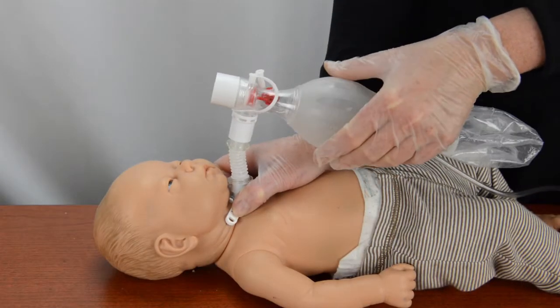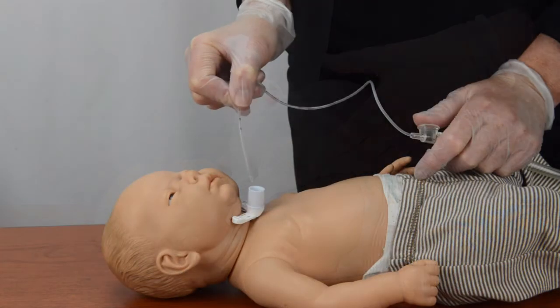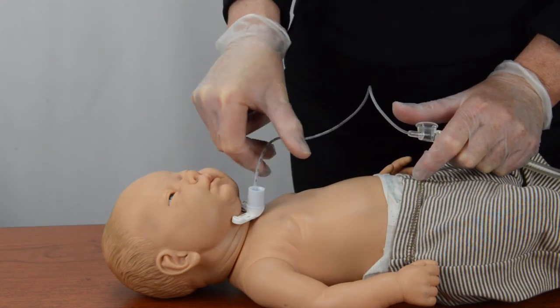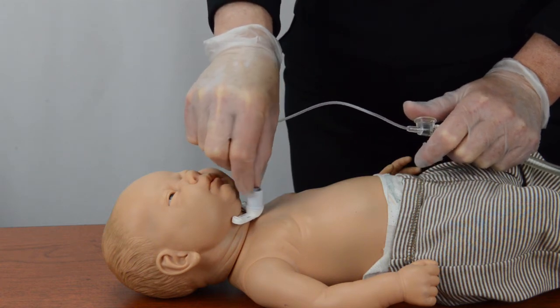If the chest does not rise, call 911 and repeat the BIBS steps with two changes. When squeezing the resuscitation bag, squeeze the bag with more force than before. When suctioning, push the catheter in twice the normal safe suction distance or until you feel resistance.